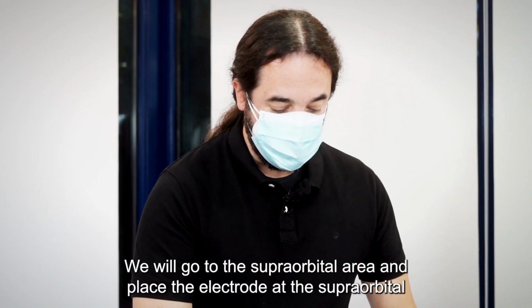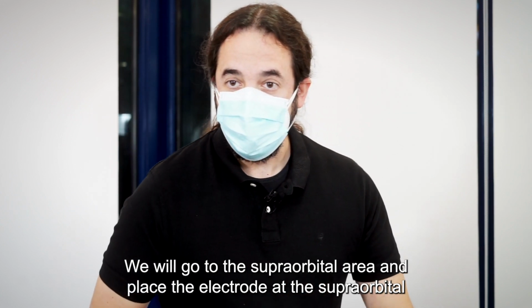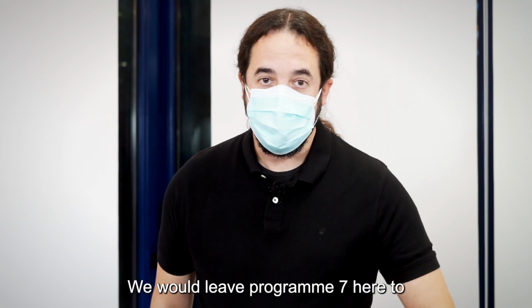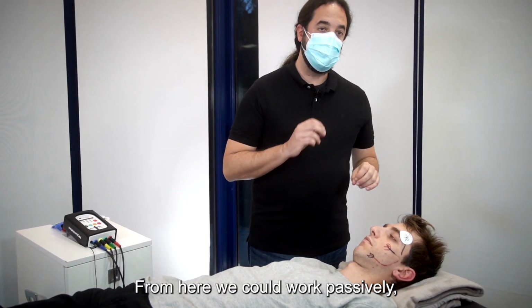So what's that? Well, we'll go to the supraorbital area and place the electrode at the supraorbital level and work on program 7. We'd leave program 7 here to optimize the neurological resources of the autonomic nervous system. From here, we could work passively.